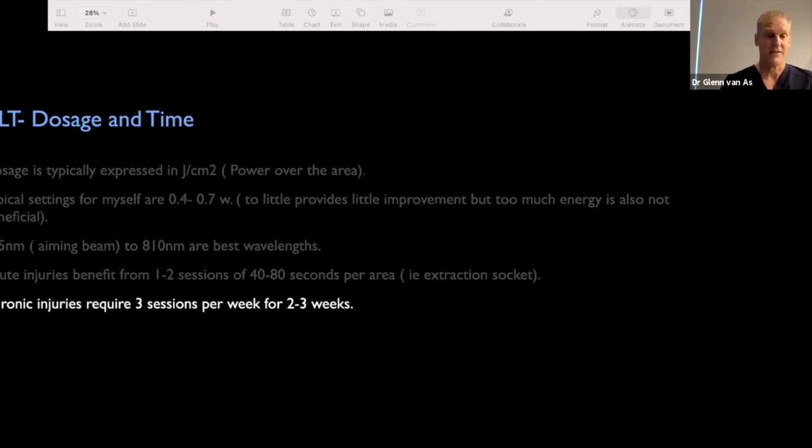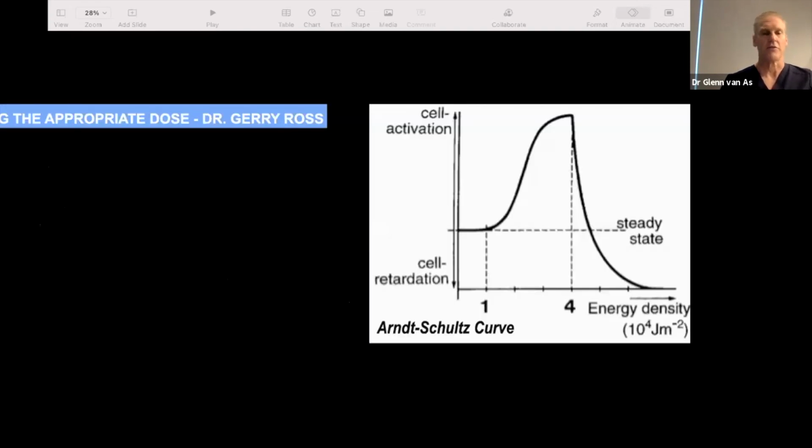But I'm telling you, it's weird how the patient will say that to me. You can look online at some of the people that have used this for Bell's palsy. They use it for 15 minutes on a Bell's palsy case with a bleaching wand, and they ask the patient the same questions. So side by side, there's a noticeable improvement with the damage to the muscles, and how the muscles are able to move better immediately thereafter. So, it can be used.